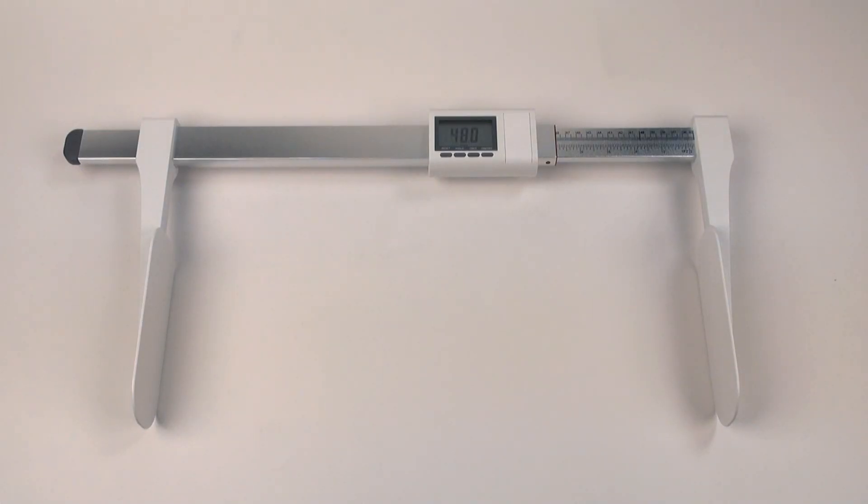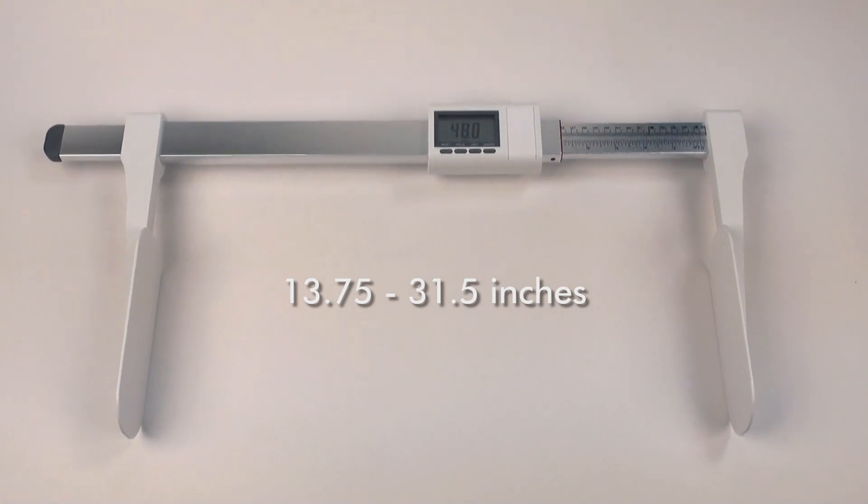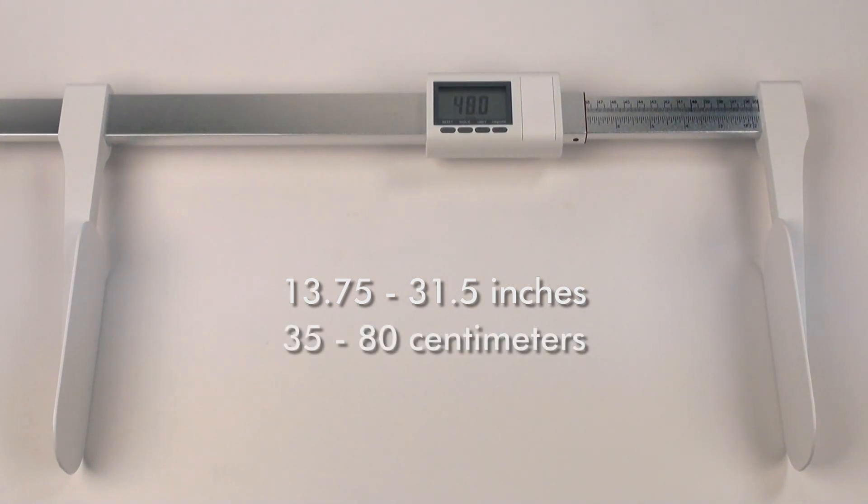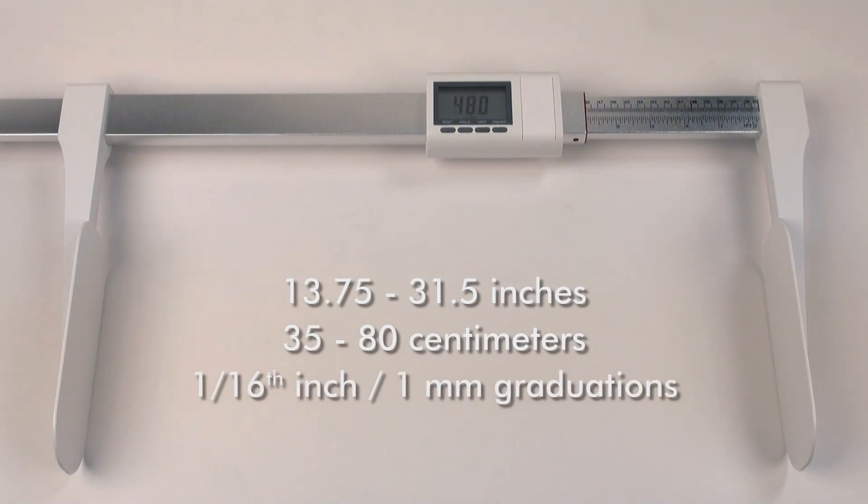The DLM is capable of measuring between 13.75 to 31.5 inches and 35 to 80 centimeters with graduation increments of 1/16th inch or about 1 millimeter.